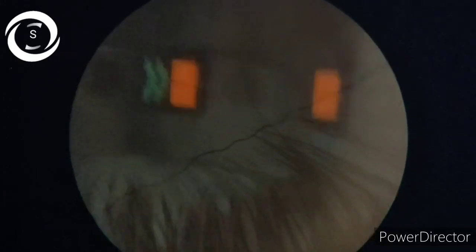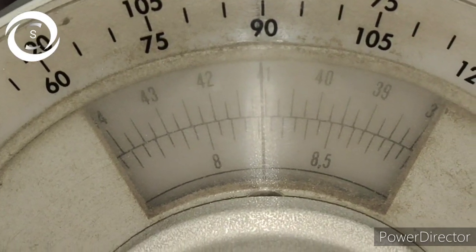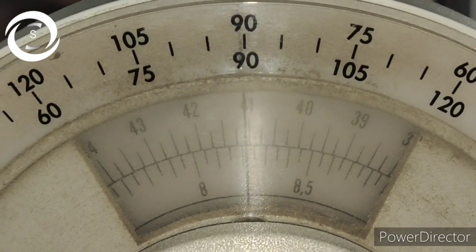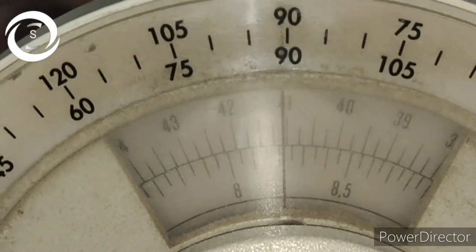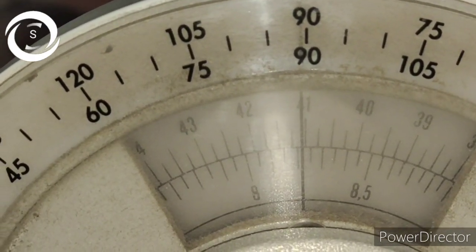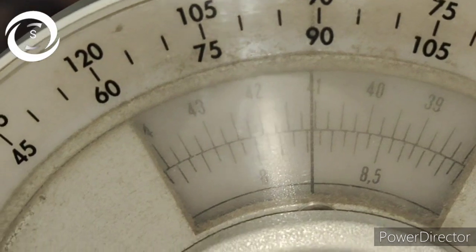So now here at 90 degrees you can see and the power of this meridian is 41, so K1 is 41 diopters power.